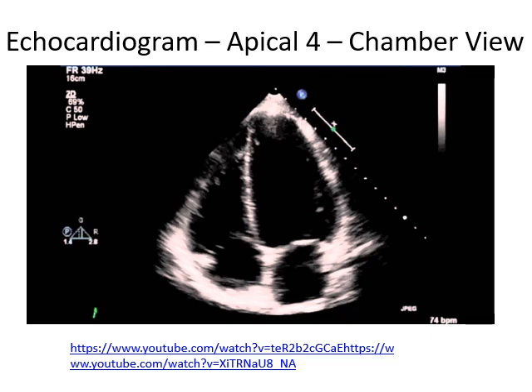So the important thing here though is to look at the orientation of the heart. It's going to look a little bit different than when we show you a picture of the heart and tell you this is what the heart looks like. This is because we're taking this ultrasound from the bottom, so the picture is inverted. Remember, the tip of the heart is called the apex.